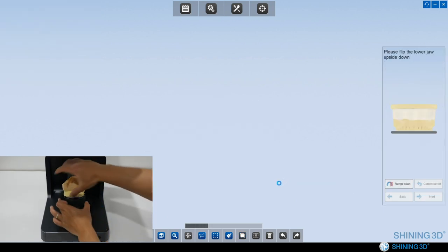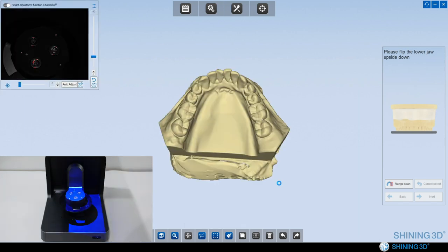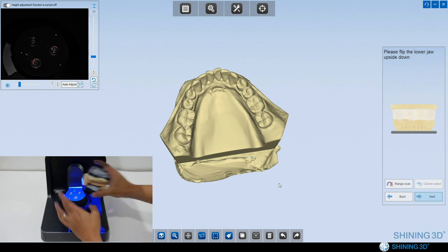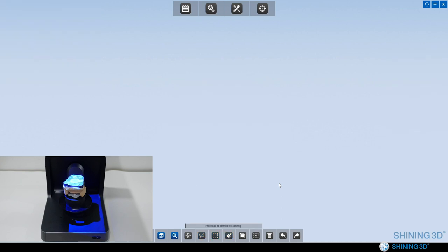Okay, here, very important, we need to flip the lower jaw upside down. We need to scan the bottom of the lower jaw, because we need to transfer the bite to XCAD, so we need to scan the bottom, and then the bottom with the transfer plate. The transfer plate will transfer to XCAD. So just like the picture in the video, next.